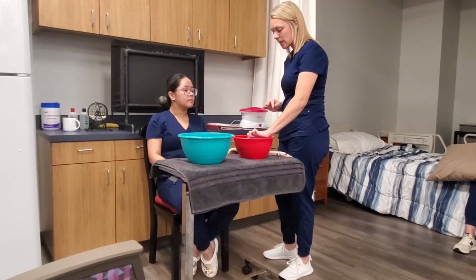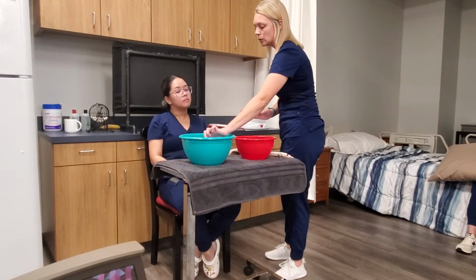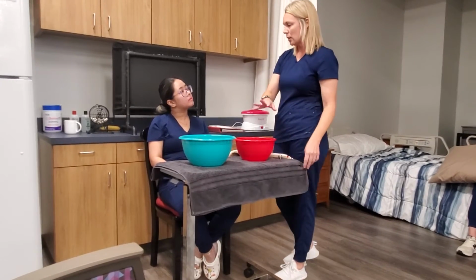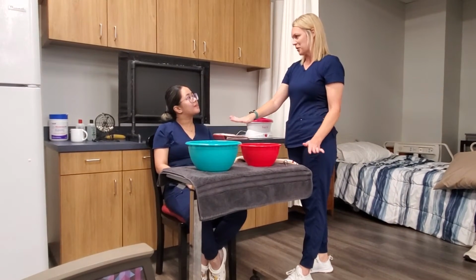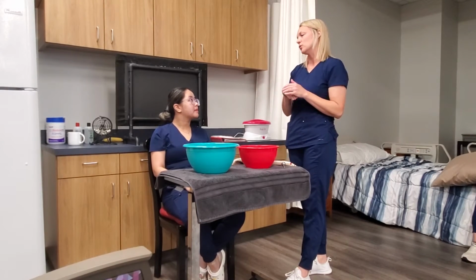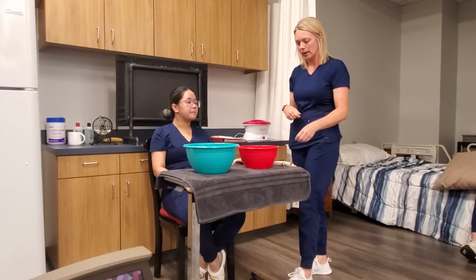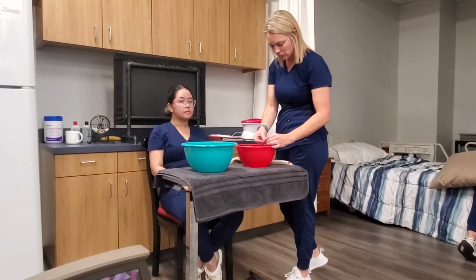And then there are some sponges in each of our baths. So this is our hot and this is our cold. Because you are stiff, once you put your hand in, you're going to squeeze very gently. Because you are stiff and painful, you're gonna gently squeeze and make sure that we don't irritate that stiffness, okay? All right, so I'm gonna check the temperatures just real quick.